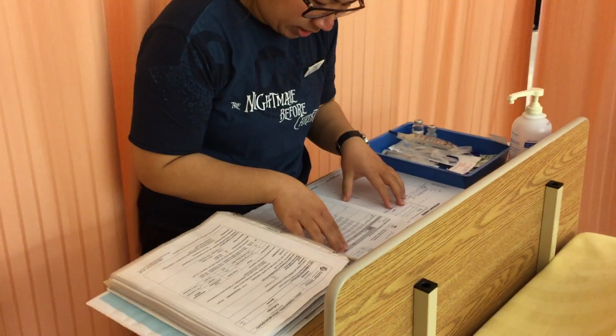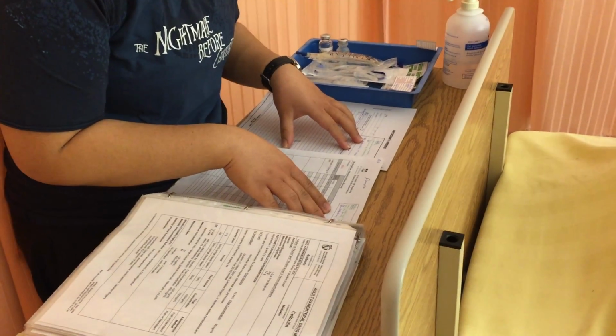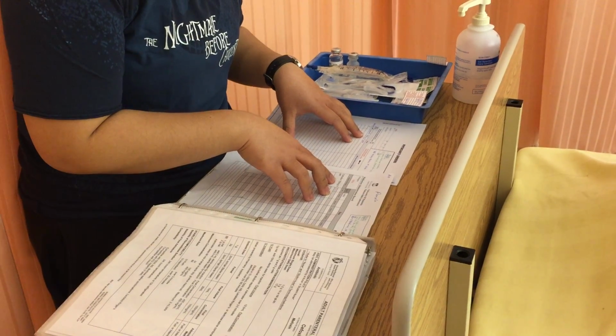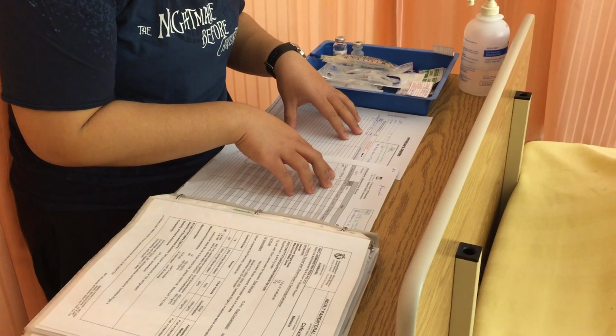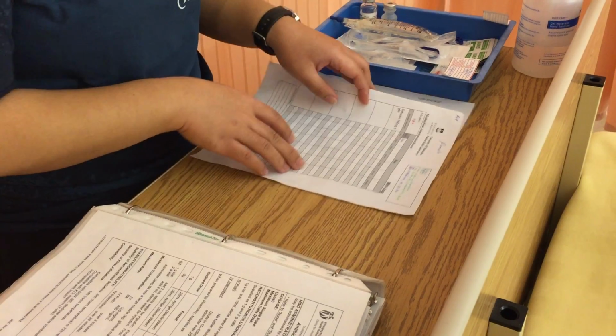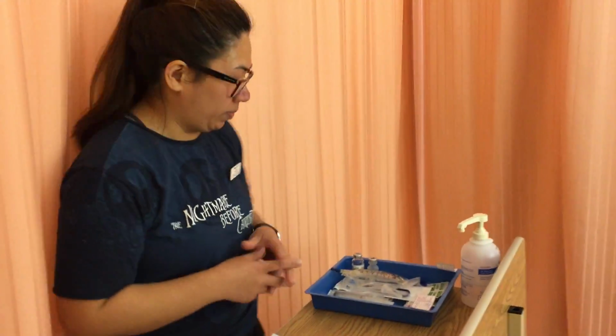So for Mr. Anthony Medina, who was admitted for peritonitis, dehydration, and nausea and vomiting, doctor's order is cefoxitin 750 mg IV every 6 hours, which is now at 1400. All right. And now I would be getting my medication in the Pixie's room.